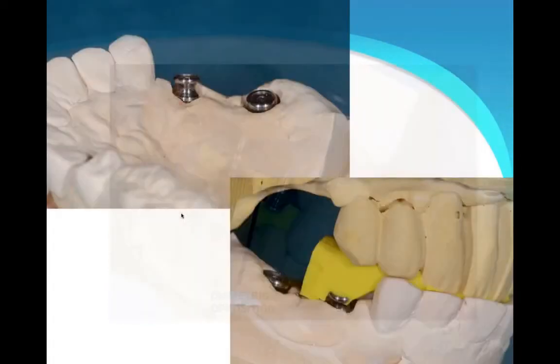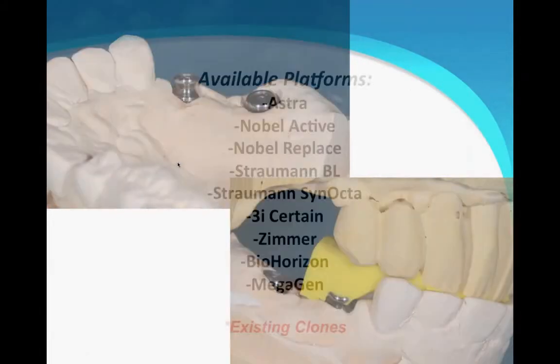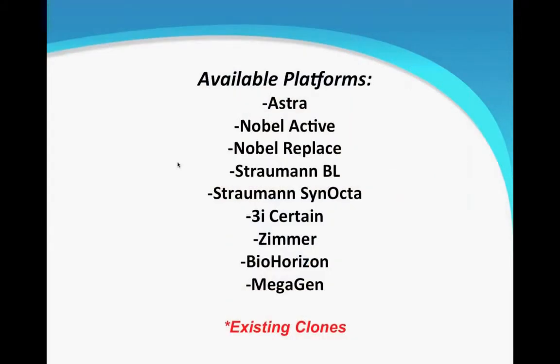Here's a case with a very deep implant. There's nothing I can do about that. That thing is so deep that you just can't use it. In this case, we used the anterior. It worked out fine. But you'll run into some of those. But almost everything that you use them for, 95% of the time, they work really easily.